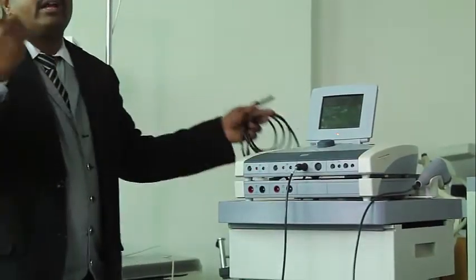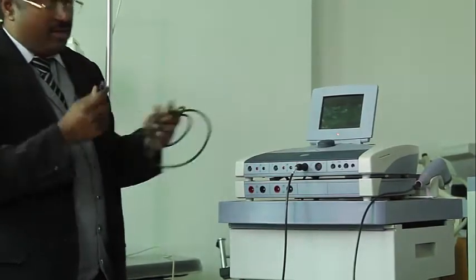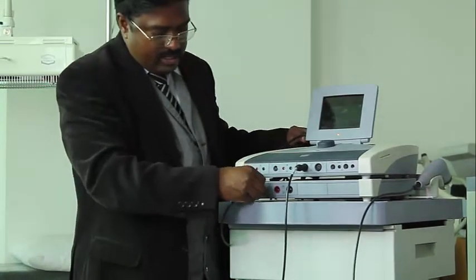Positive is anode, negative is cathode. So here, this is the negative, the cathode. One channel has two electrodes, positive and negative.